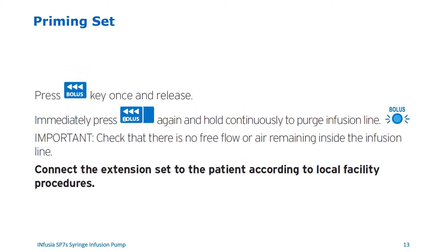Priming the set. To prime the set, please follow these steps. First, make sure that the set is not connected to the patient while priming. Next, press the bolus key once and release. Then immediately press the bolus key again and hold continuously to prime the infusion line. Make sure that there is no free flow or air remaining inside the infusion line after priming is complete. After following these steps, you may now connect the set to the patient according to your facility's best practices.